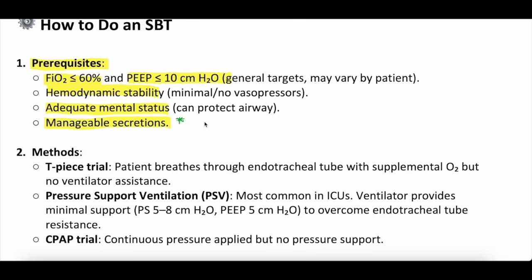And then the other thing, like anticipated procedures: are they going to the operating room in 5 hours? If so, maybe you leave them on the ventilator. Do they need an MRI of their brain and a whole spine in 2 hours? You know, that's a long test. Maybe leave them on the ventilator. So just kind of anticipated clinical course is another thing to think about.